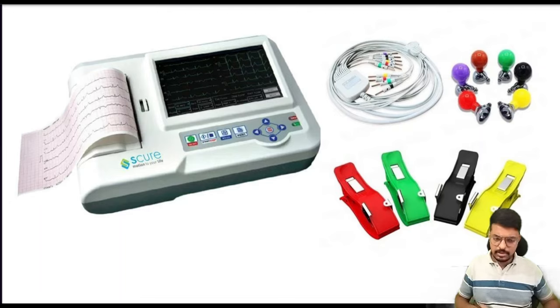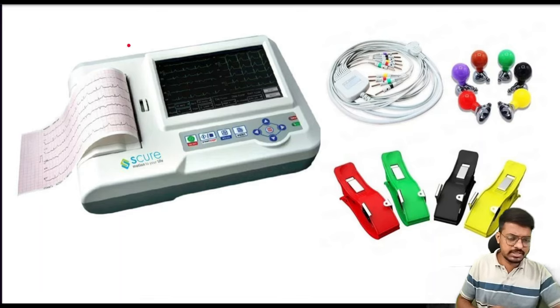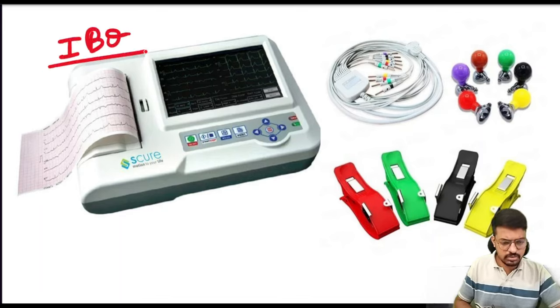First of all, I will start with a very basic thing, and all of you know it from your clinical setting. I think you have seen this image. This is the ECG machine image. It may come as an image-based question in your upcoming exams. IBQ means image-based question.